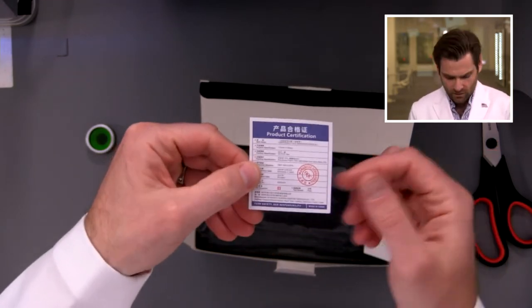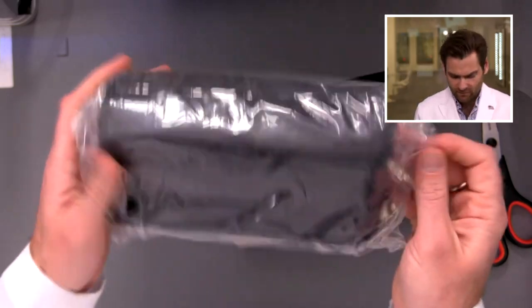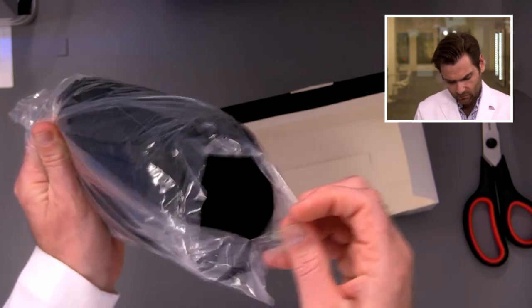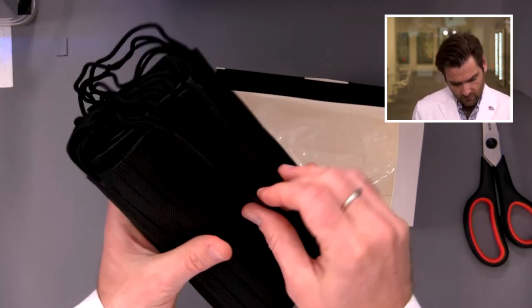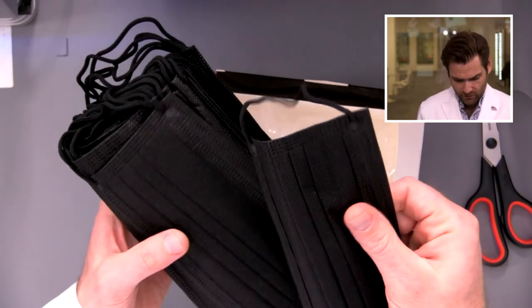Right away you're going to see the product. This is a really nice color — they spent extra for that. This is a great package, it's nice and sealed. The plastic is really thick, not cheap plastic. These masks are really thick — I really like how thick they are.